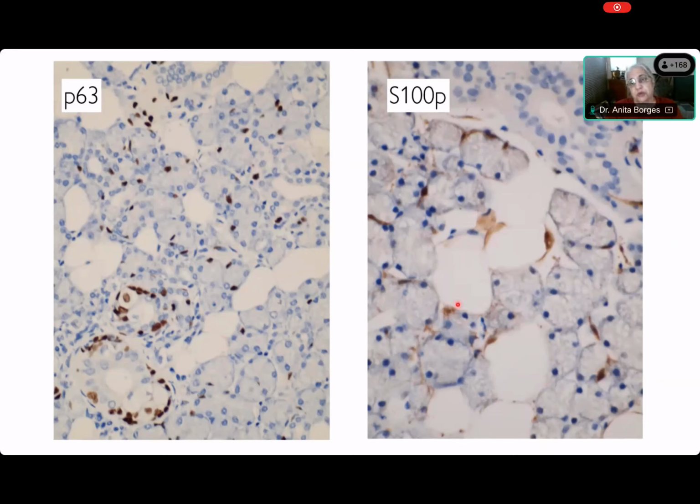And now you can see how beautifully the myoepithelial cells are marked on the outside of the acini. You can hardly make out that there is another layer, but the nuclei, that's where you have to look for expression of S100 protein in the nucleus. And the nucleus of these cells has got expression of S100 protein. S100 protein therefore marks myoepithelial cells. It does not mark basal cells in the parotid.